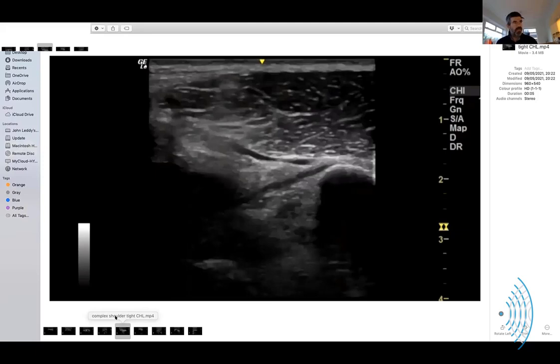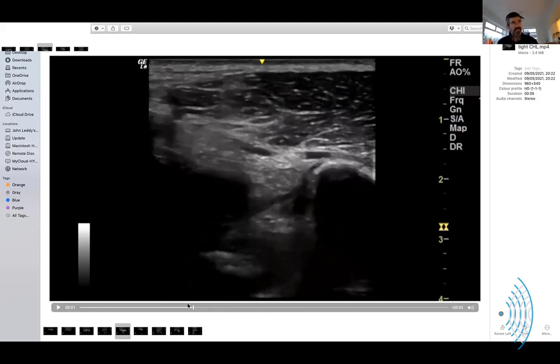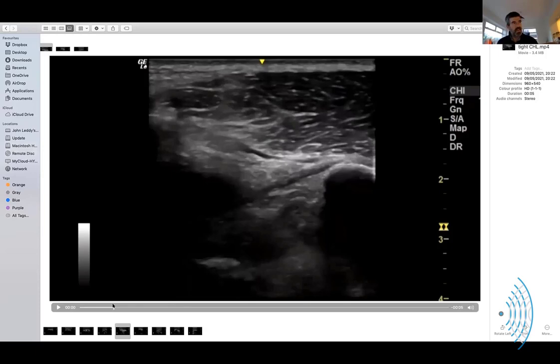When I first started scanning him, his shoulder was a bit stiff. And I did wonder if this was going to be some sort of frozen shoulder. Yeah. And that's the coracohumeral ligament there. Did I see the coracoacromial ligament at the same time? Yeah, probably that's or certainly the plane of. But yes, there's it loosen, there's it tighten.